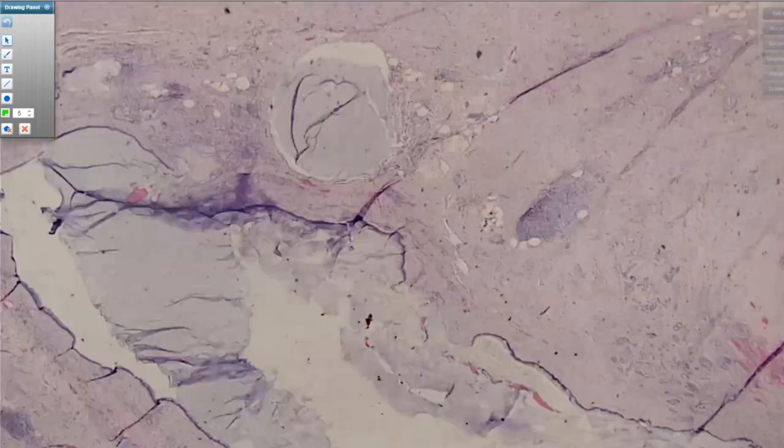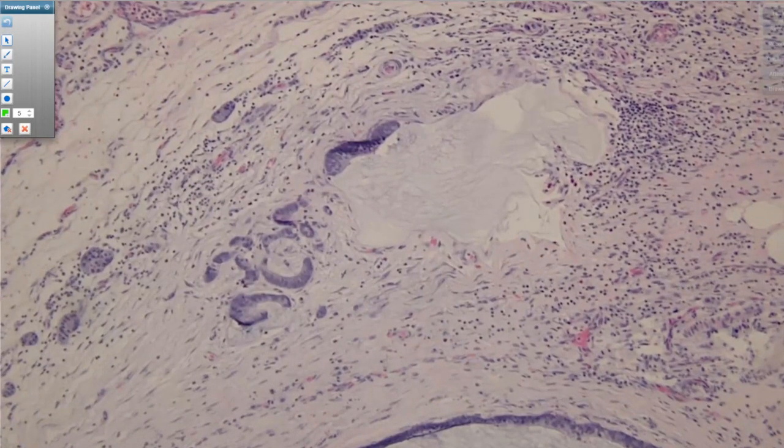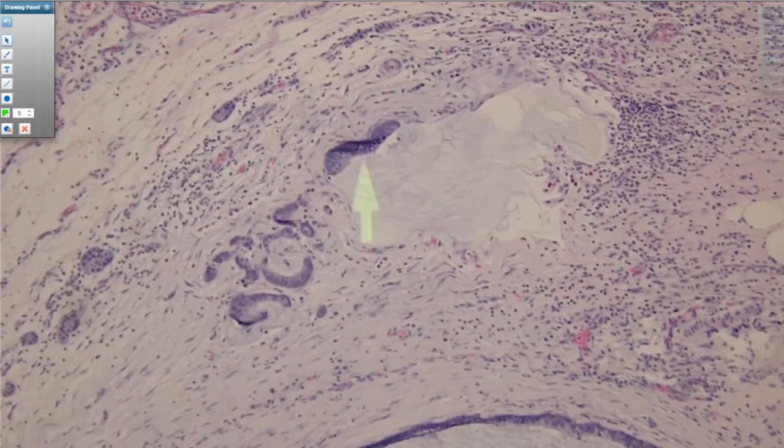So a couple of other examples. Here's one that probably looks very reminiscent to some of those incompletely lined glands. But then here you have just enough cells with too complex architecture to really account for a ruptured gland. And so this also was enough to call a very small focus of invasion here. It's a little more angulated, a little more infiltrative, almost trying to butt off here like into a single cell, as opposed to something that seems to be rimming a space.